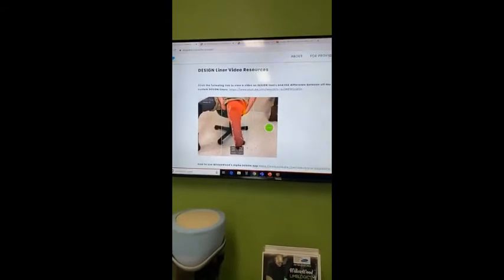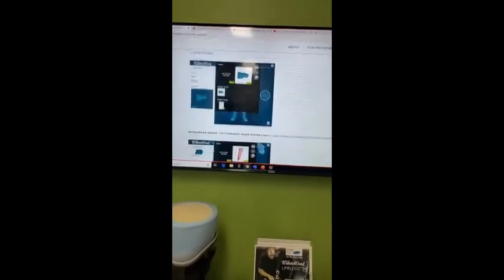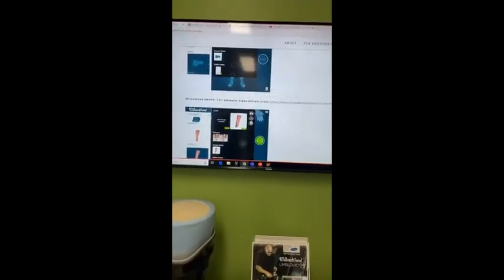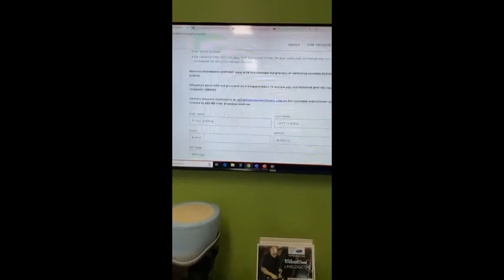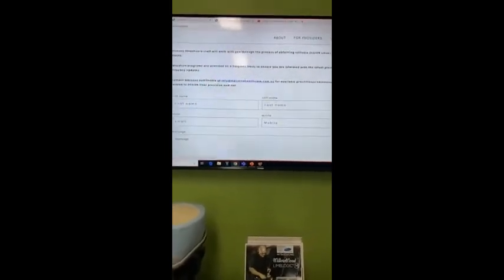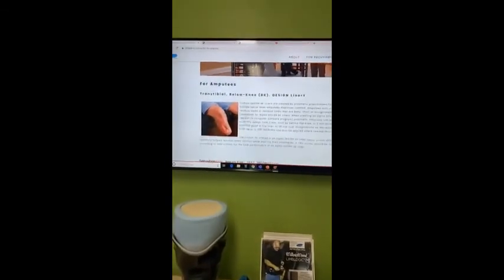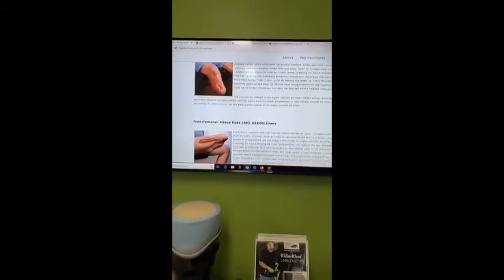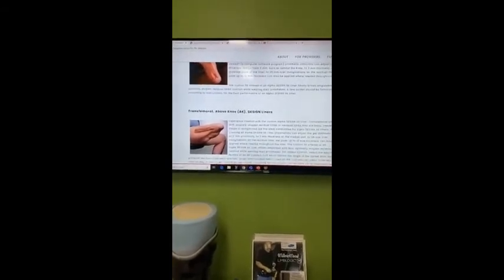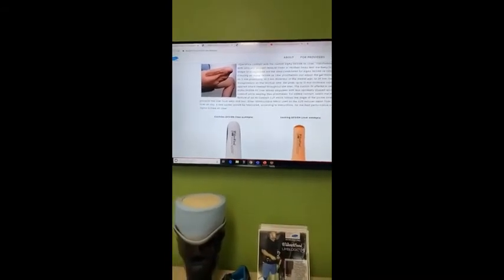We've got the videos and resources. So it's a good handy tool for practitioners and for amputees wanting to know more about design liners. With amputees, we're just explaining the process, what design liners can be worn on, what type of stump shapes, and how they benefit over an off-the-shelf liner.